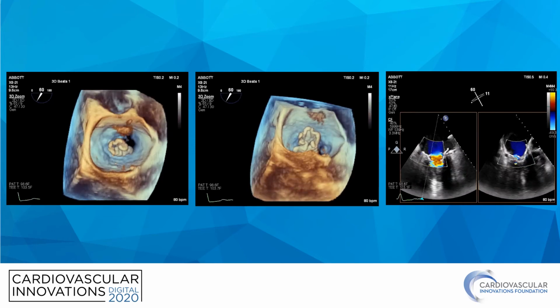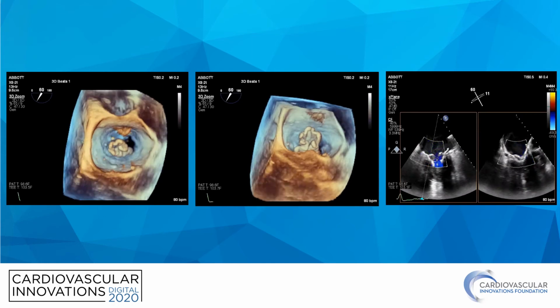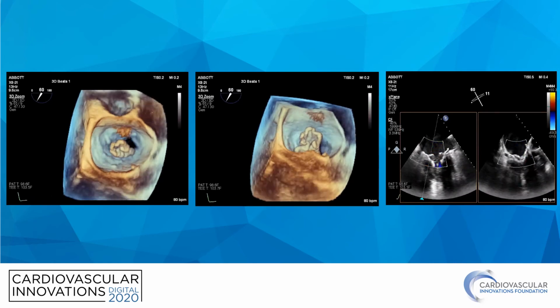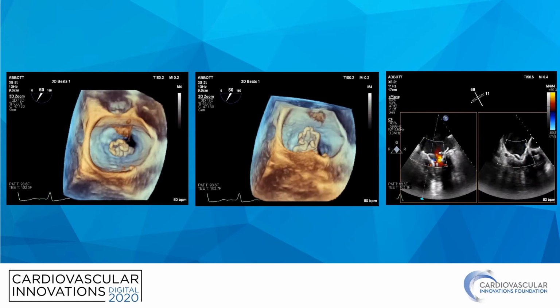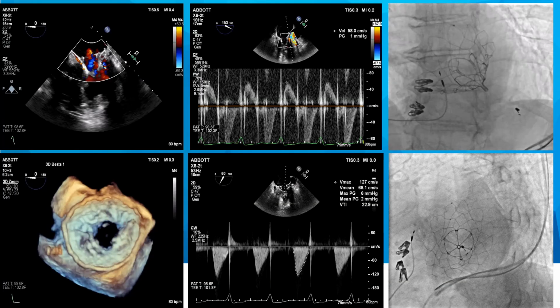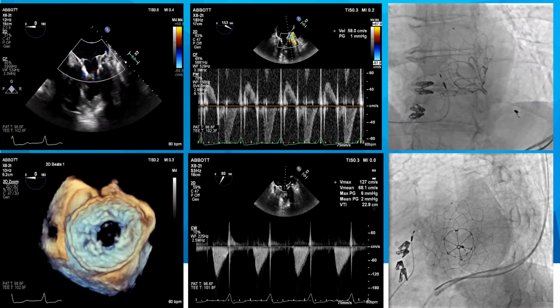After the position is deemed satisfactory, the valve is then released and assessed for paravalvular leak and mitral valve leaflet function, and adequate tension is applied to ensure that the valve is anchored, and then through the apical pad that tension is maintained and transferred to the apex. So these images are after the valve has been deployed and anchored to the apex.